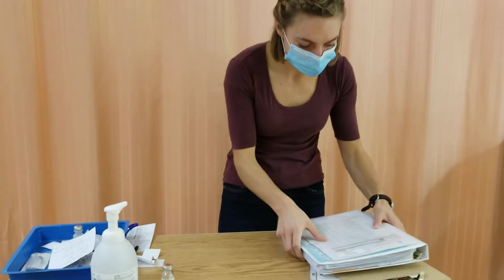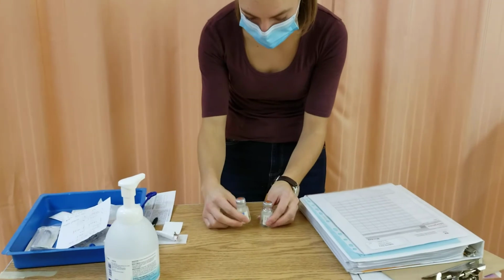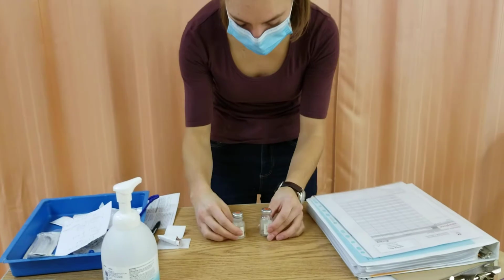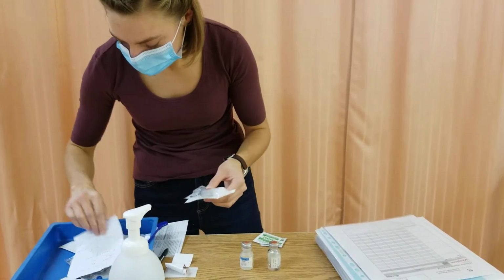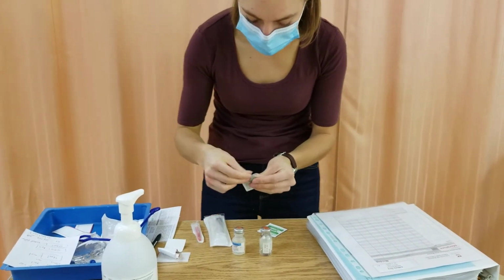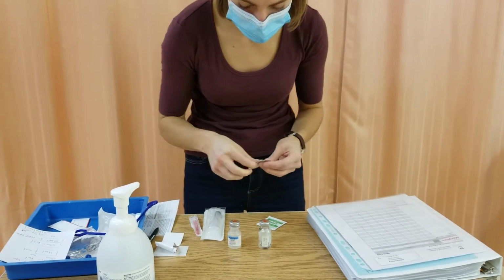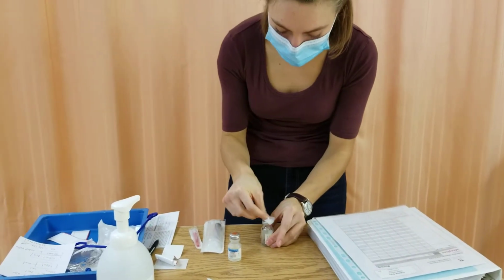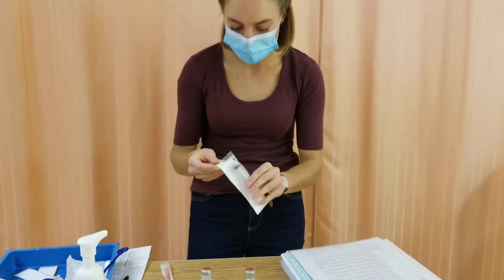That's done. I'm going to take my medication and my sterile water, which I'm drawing up 3.4 mils. So I swab for 30 seconds and let it dry for 15. Swab for 30 seconds and let it dry for 15. And I'm going to wing this back.